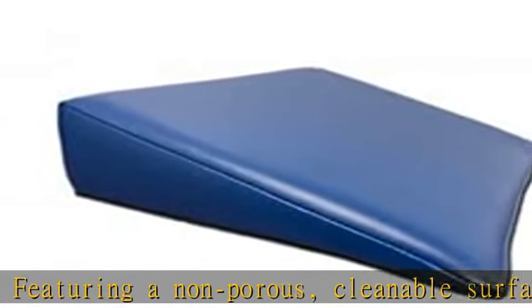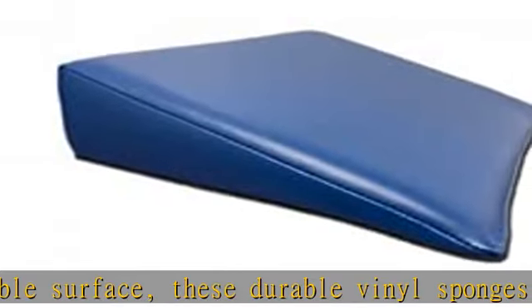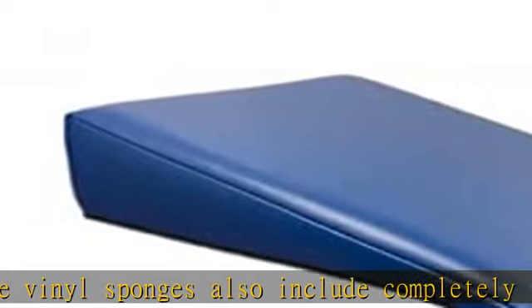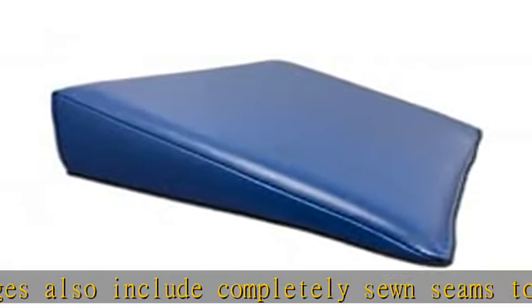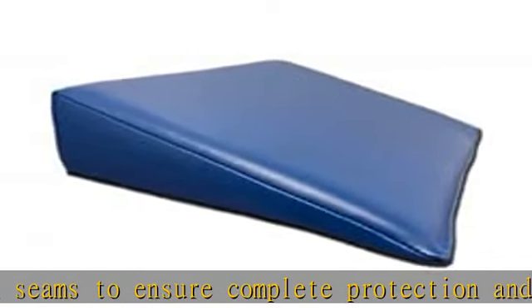Non-stealth sponges are formed with traditional angles and do not feature the proprietary flared angles. Non-stealth or non-flared sides may show artifacts when imaging, specifically when coding is applied.